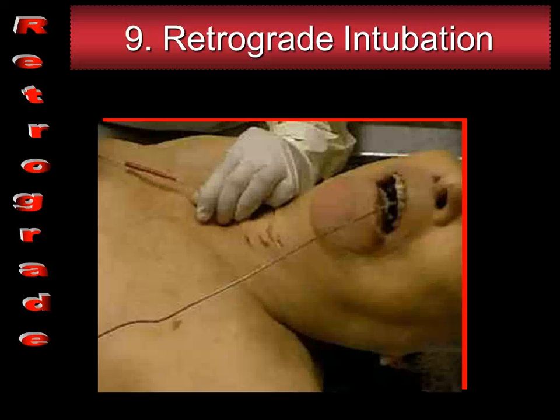And what you do is they make a wire. It's out of our kits, whenever we do our central lines, but you can get the wire by itself. You just pass the wire through, goes up, grab your McGill inside the mouth and pull the whole wire through, and then put it through the eye, shove the tube down. And as the tube goes inside, it hits where the wire's coming through the trachea, and then pull everything out, and you know exactly where it is.